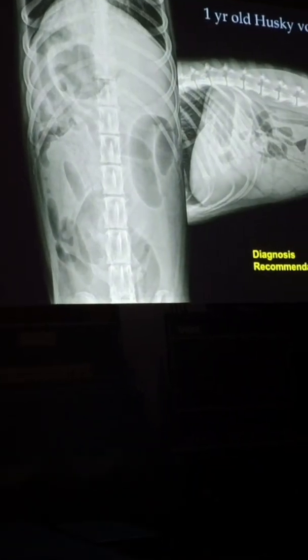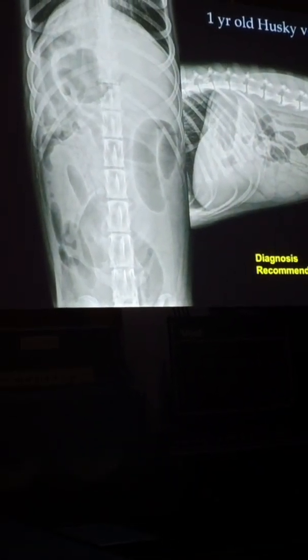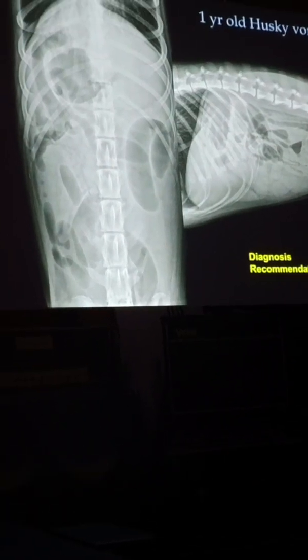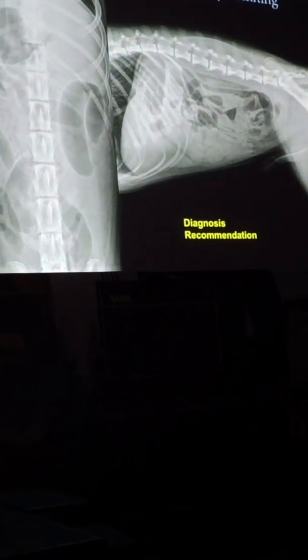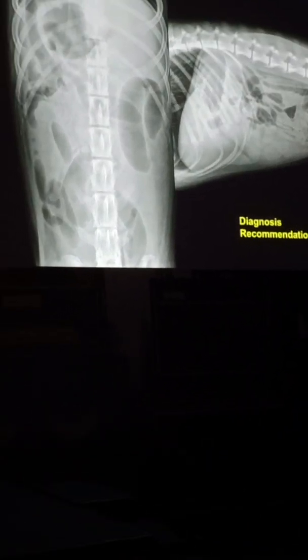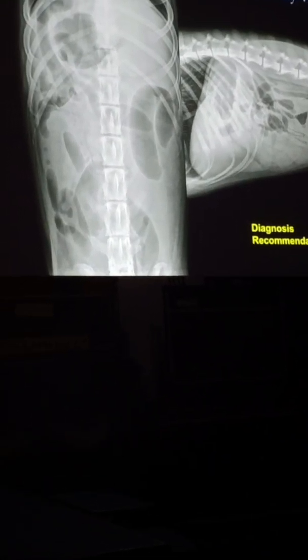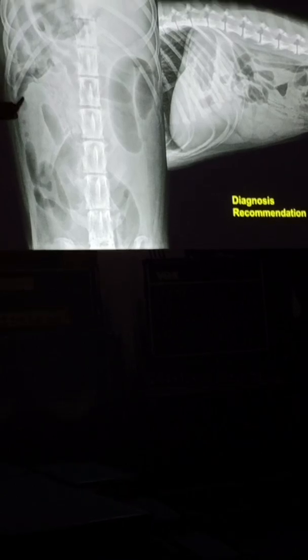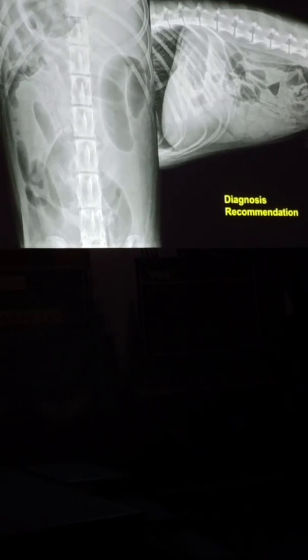What could you do next? What is something I taught you the other day in an old radiographic technique that we revisit, what I told you yesterday with GI obstruction? What is a routine set of abdominal radiographs for me? What are we missing? We're missing the other one. Okay, I'm going to put you on the spot.